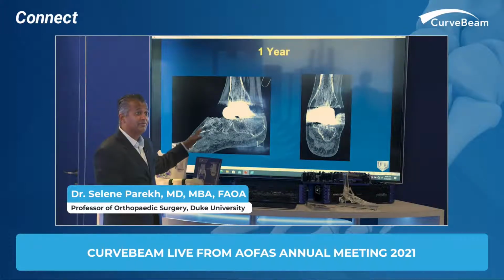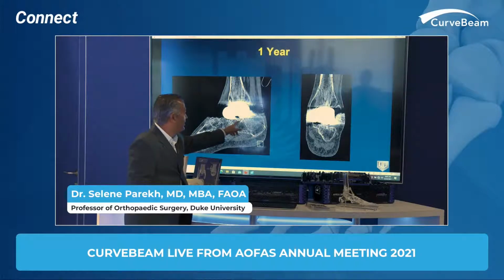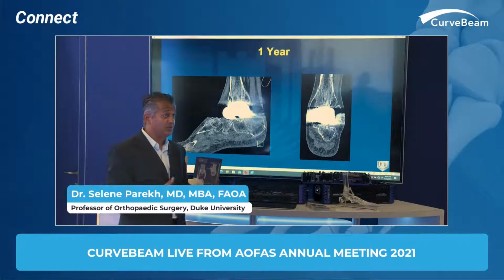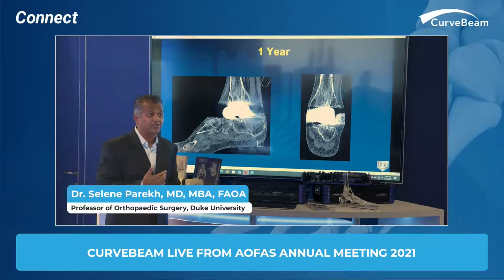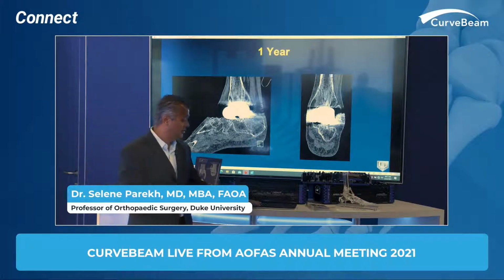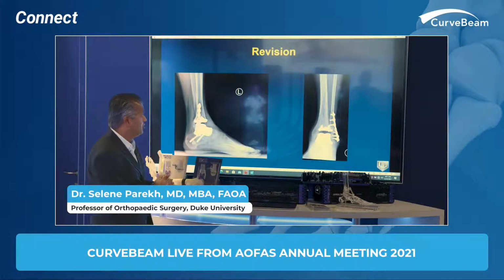having more pain. Now we can get that weight-bearing CT, time's elapsed, and you can see that she's already got some subtalar and ankle arthritis in this joint. And maybe that was pre-existing on that earlier CT and we didn't appreciate it because it wasn't a weight-bearing CT. Maybe it evolved over the course of the year. Hard to know that without knowing the weight-bearing CT preoperatively. But ideally, to have that weight-bearing CT scan done preoperatively would have helped us out.